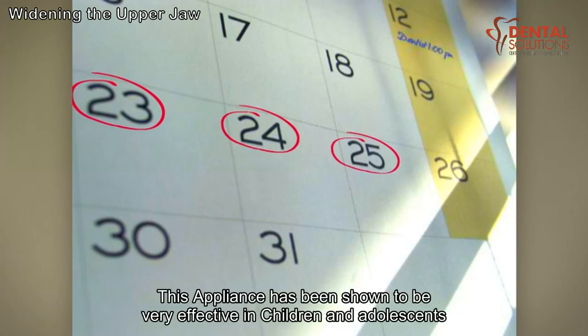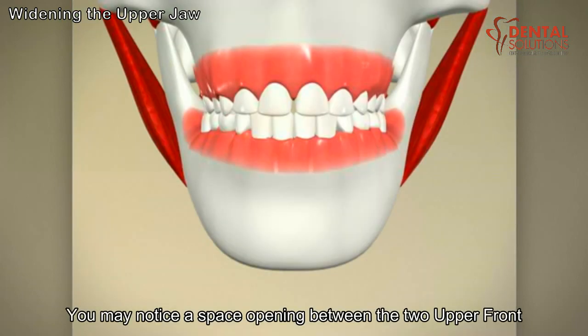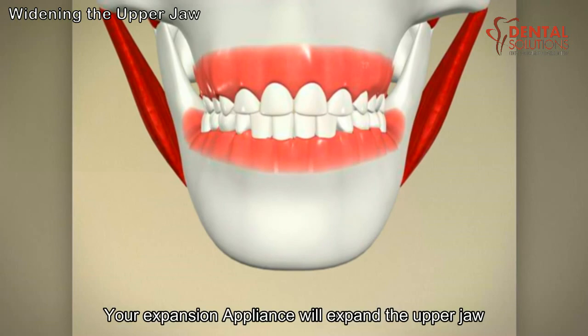This appliance has been shown to be very effective in children and adolescents. As the jaw widens, you may notice a space opening between the two upper front teeth. The front teeth may move back into place on their own. Your expansion appliance will expand the upper jaw.